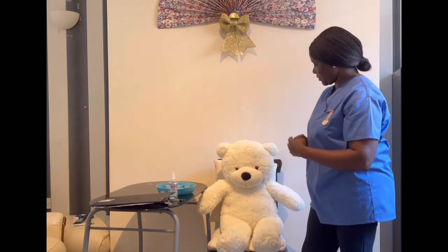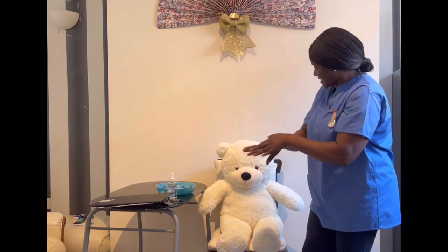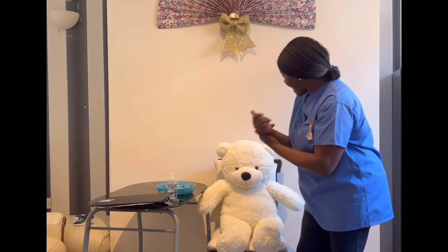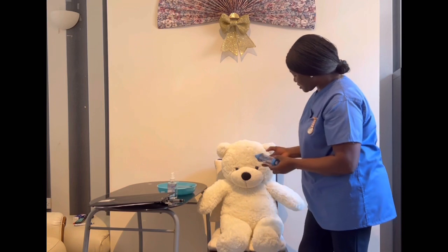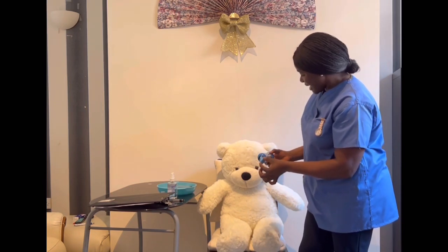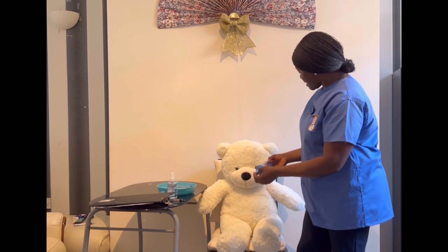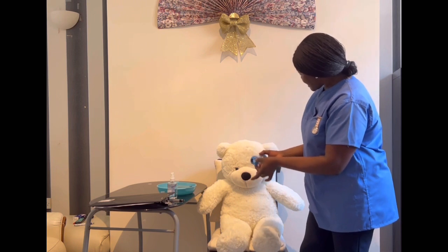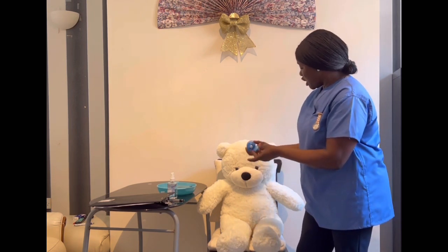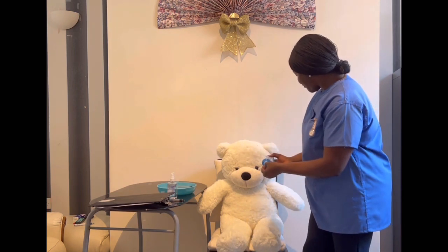Oh, hi, nurse. Yeah, like I said, I'm just going to give you some general advice. Your spacer device is single use and it is for you alone. Don't share it with anyone. Make sure you clean it according to the manufacturer's guideline and make sure it is not damaged. Within 6 months to 12 months, 6 months to 1 year, if it is damaged or even if it is not damaged, you need to get a new one from your GP.